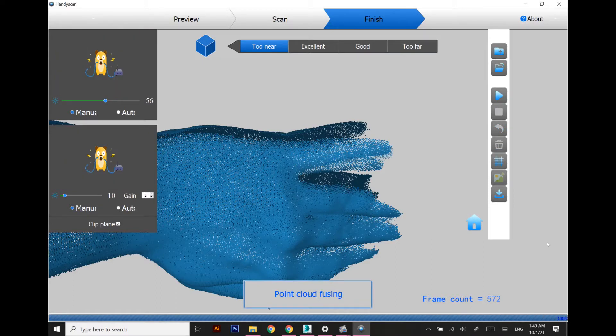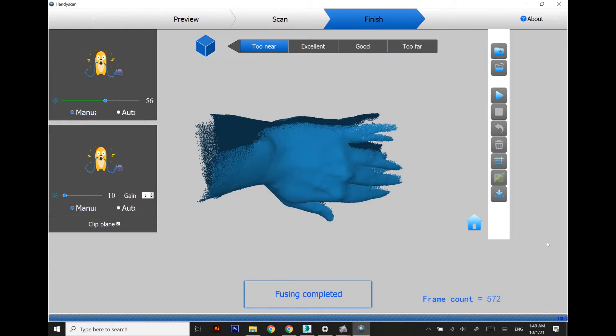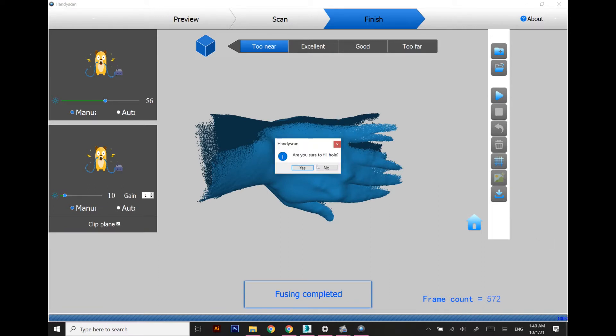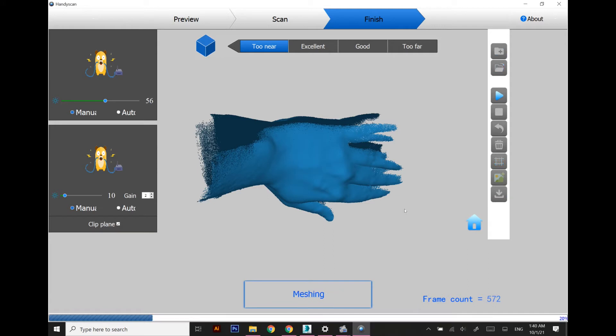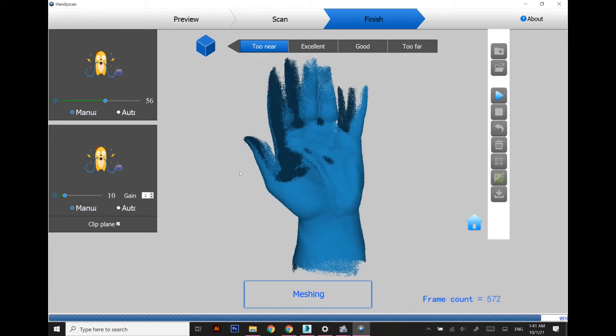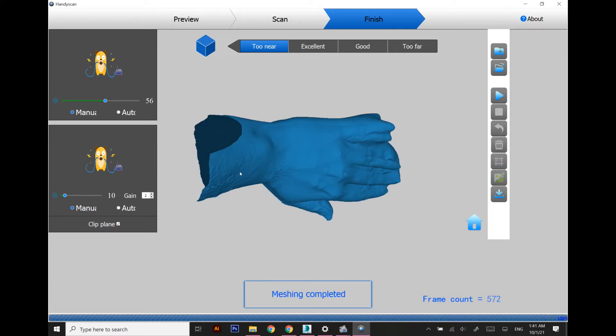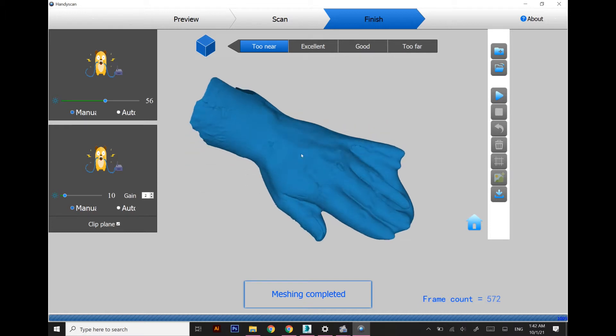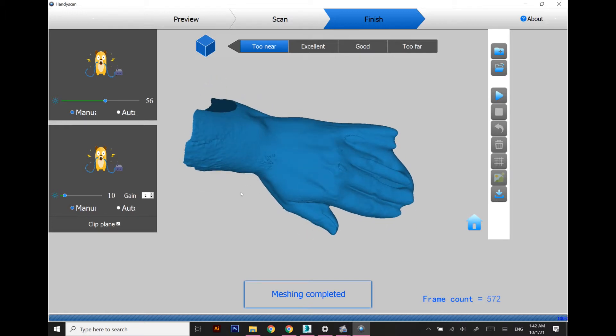Once the scan is complete, I'm going to convert it into a mesh and let's see how this whole mesh turns out. After meshing I realized that it is quite okay for me.